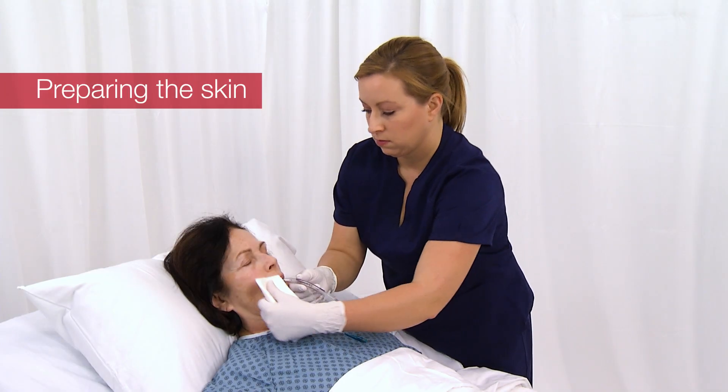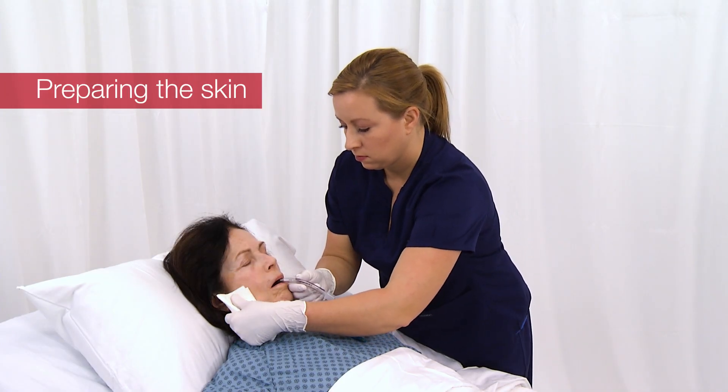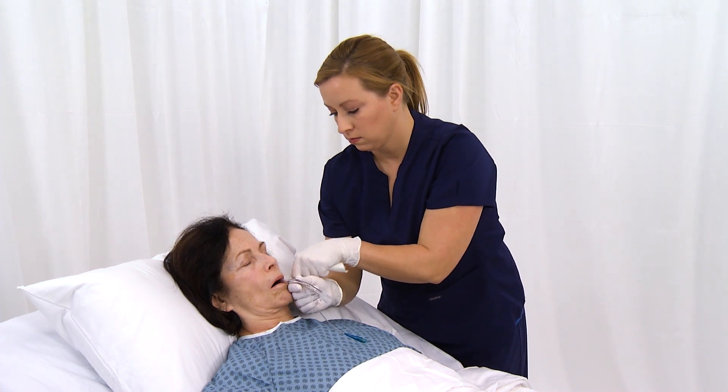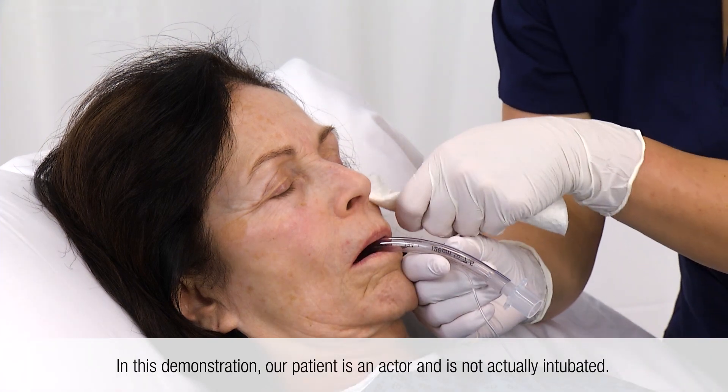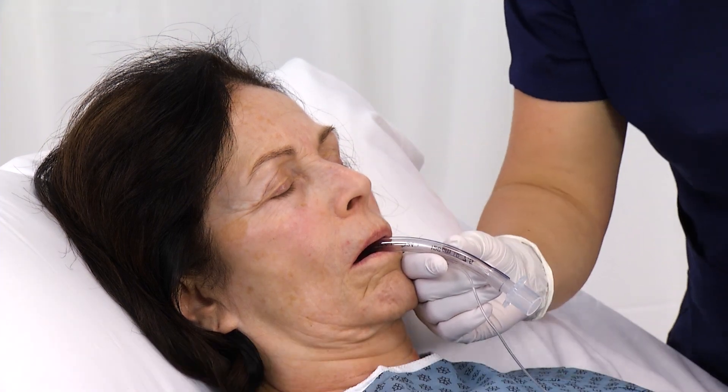Before applying the device, the patient's skin should be clean, dry, and free of oily residue. Do not use skin gel wipes or other skin preps with the oral endotracheal tube fastener.